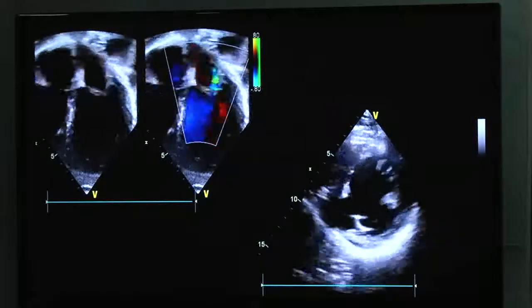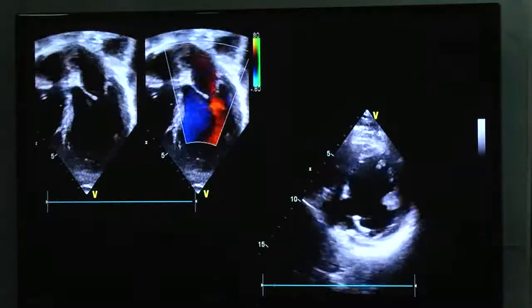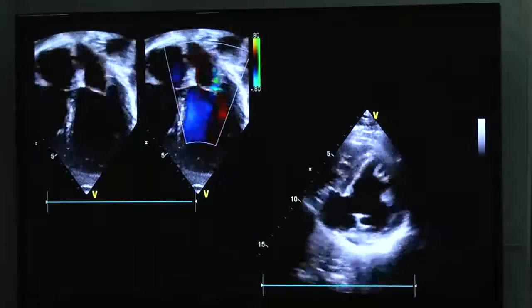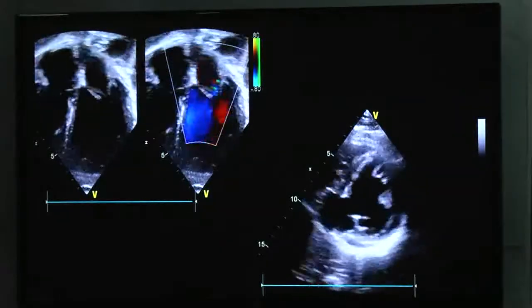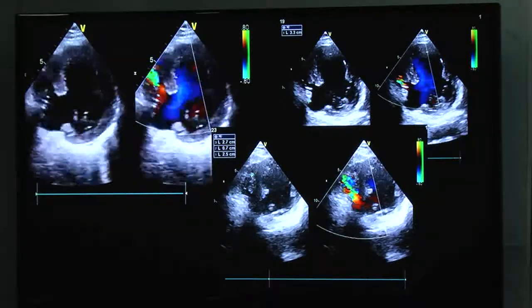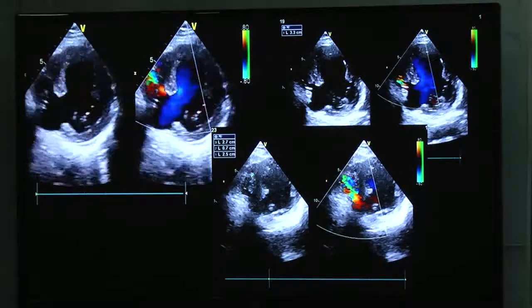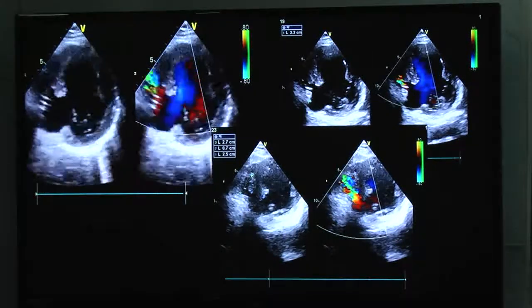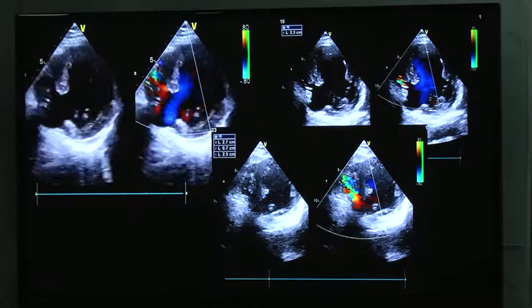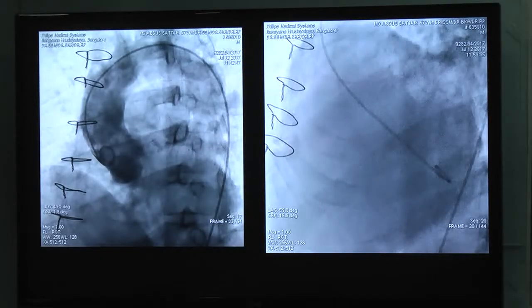This is a post-infarction VSD. Okay, so there is a large apical VSD with reduced function, and you can see the VSD here, completely torn septum. So in adult, these are very difficult ones to close. Again, as long as you have done, and you have seen, you can see the VSD here. Okay, as long as you have looked at it, see, I have looked at the size even before, what device I will be taking. So your TE will help you extensively. And once you know, I'm not going to go through this wholly because it is a long case.